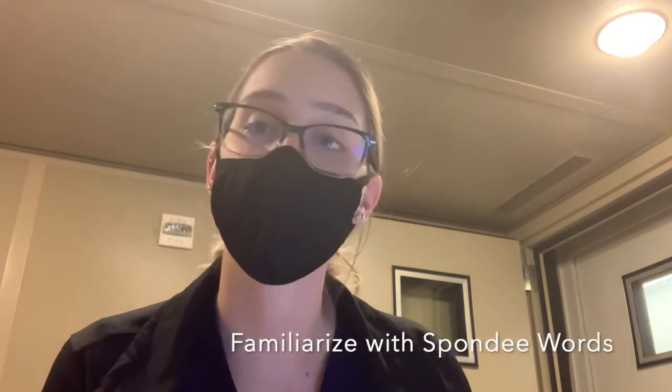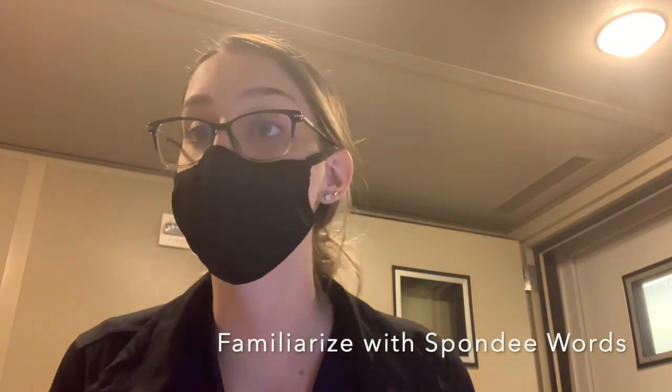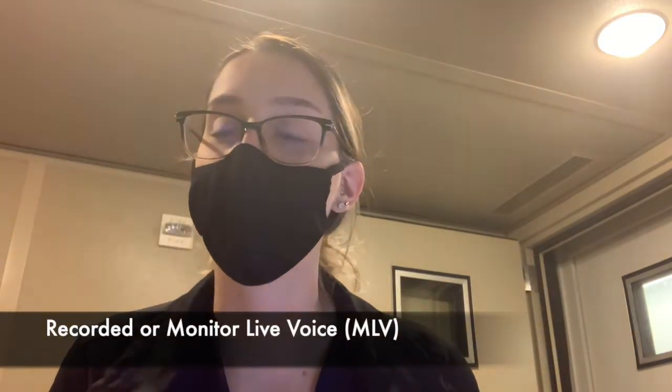From there, you're going to want to familiarize your client with six spondee words, and instruct them to repeat the words back to you as they hear them. If they think that they don't understand or can only hear it slightly, you still want them to try and guess what the word is. This test can be done with monitored live voice, or you can do it with recorded speech. And today we're going to be doing recorded speech.